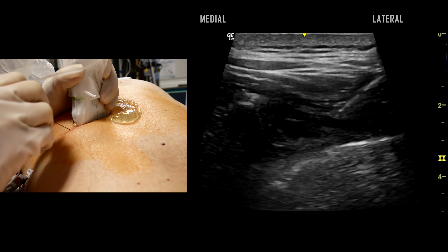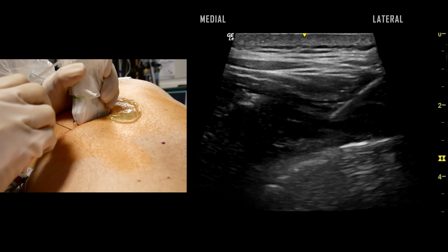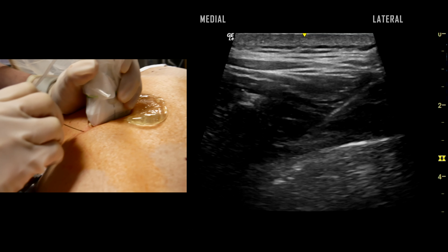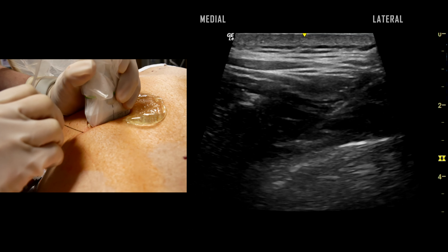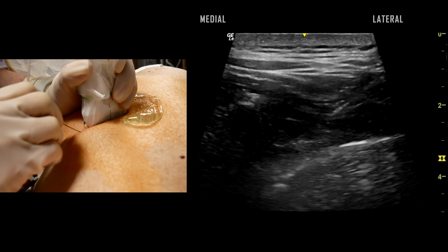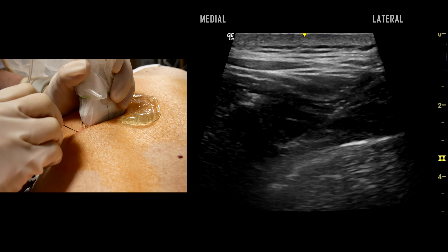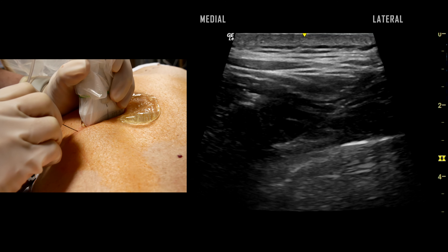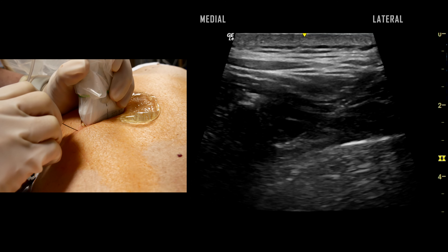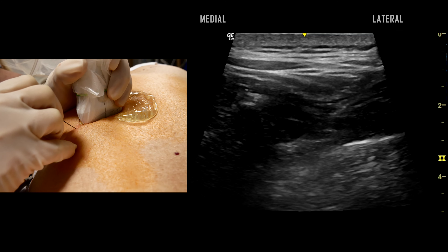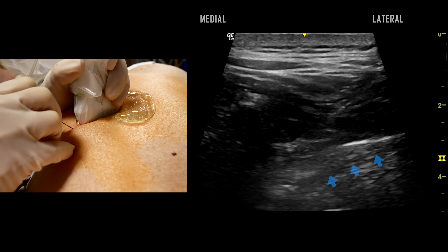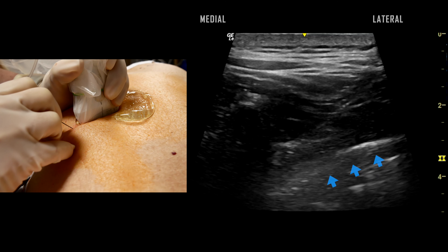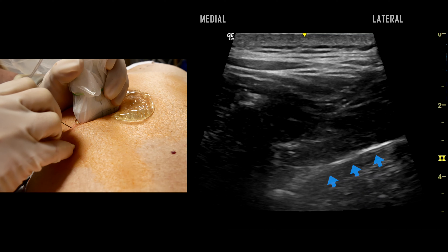The block needle is guided to penetrate the superior costotransverse ligament. As we saw previously, careful aspiration and injection of local anesthetic in aliquots will show depression of the echogenic pleura away from the needle.